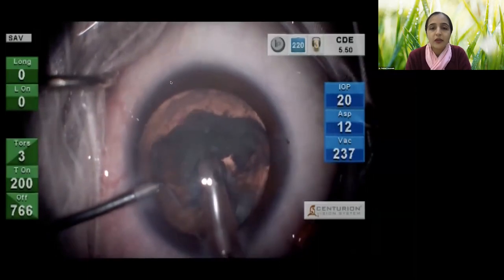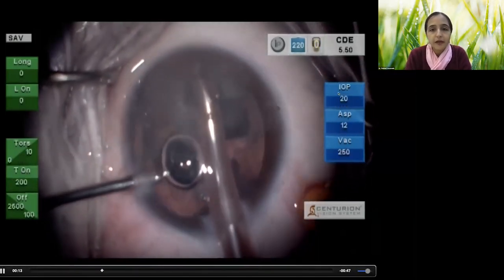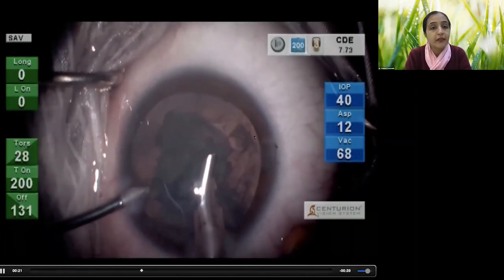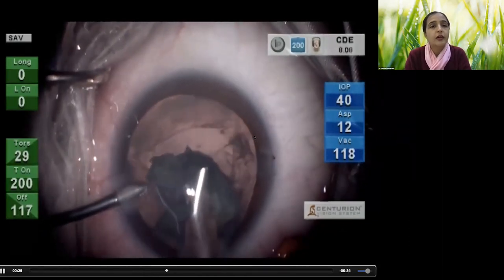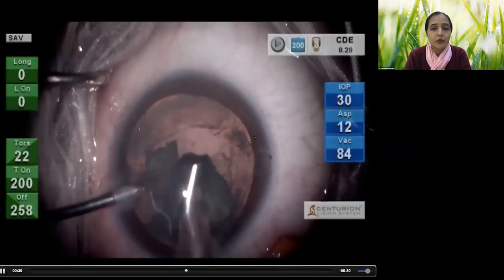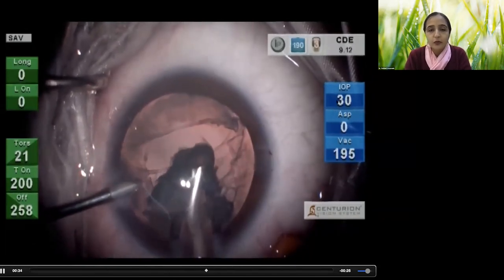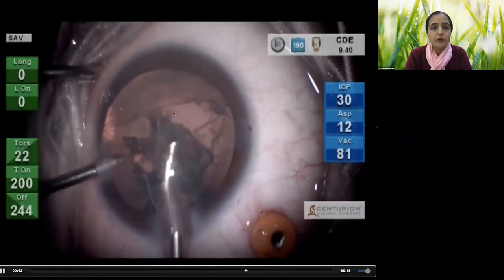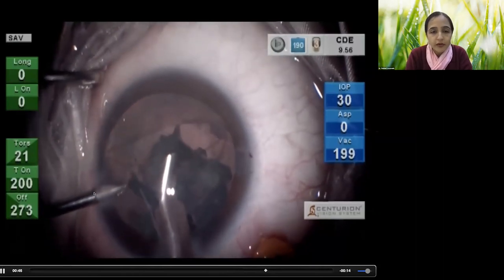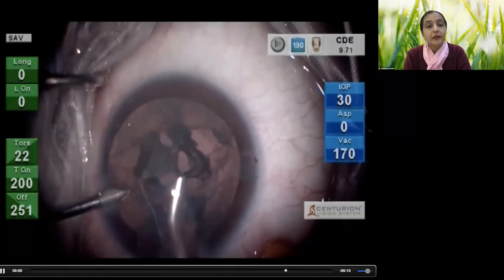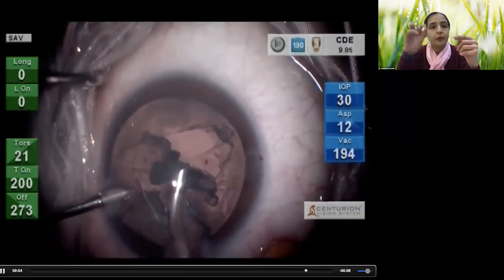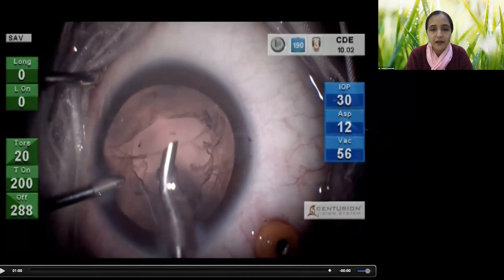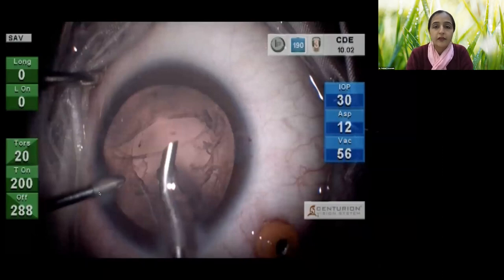With no vitreous, you're not worried about pulling anything in. Low flow rate, low vacuum, and minimal energy are used to remove the remaining nucleus — and despite the large open capsule, nothing is going behind. The irrigation has been separated from the phaco probe, so the phaco probe acts as an aspiration device only — something like bimanual phaco. We managed to remove the entire nucleus without causing further damage. Next is cortex removal using bimanual irrigation-aspiration, which allows a closed chamber and stress-free 360-degree access.